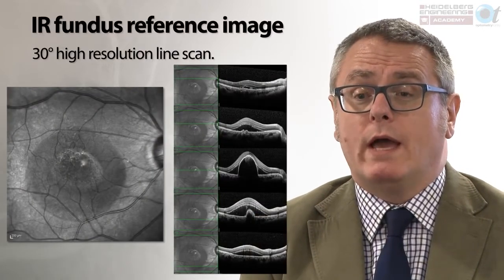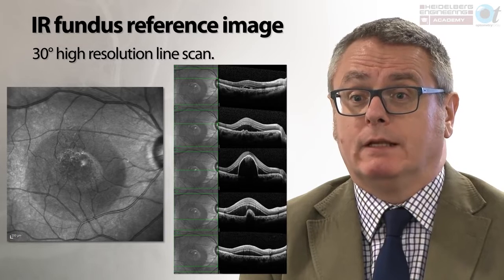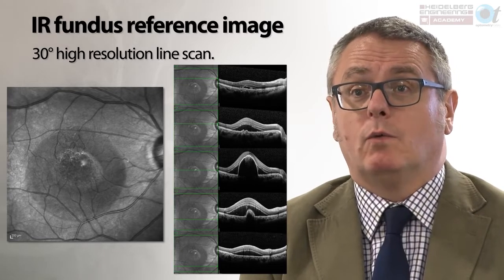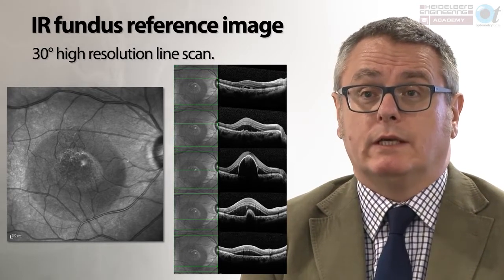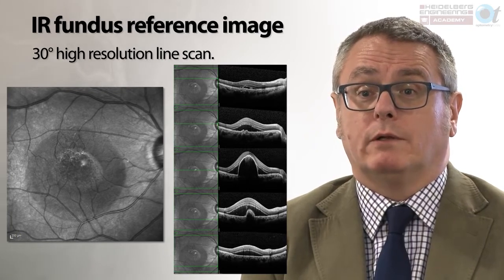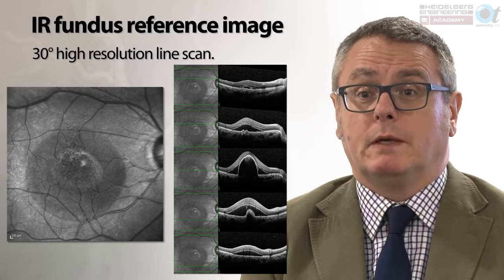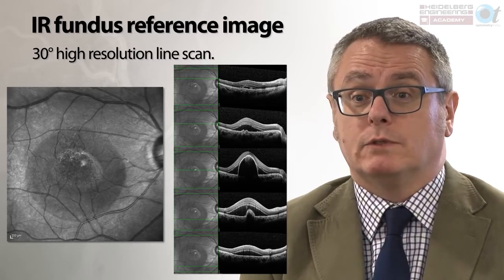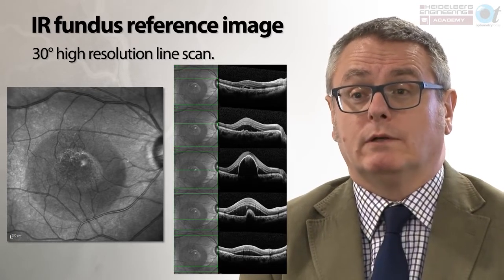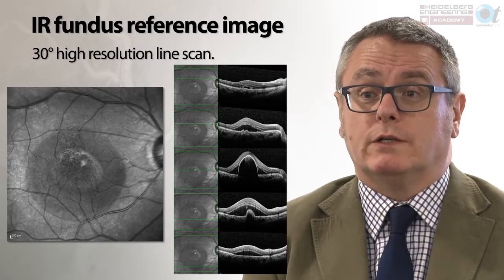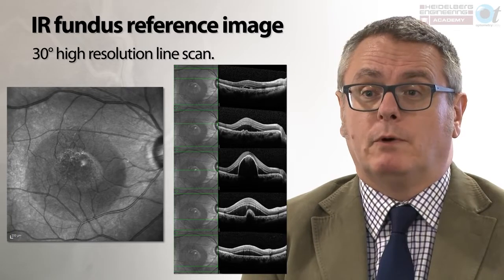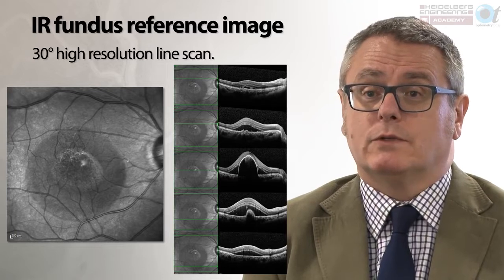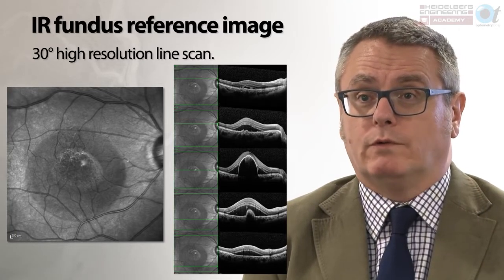The first question is where do you place your OCT scan? The simple answer is use the clues you see within the fundus reference image to guide where that should take place. In this example we can see a patient exhibiting a large area of subretinal fluid with a central oval-shaped pigmentary change, probably consistent with a retinal pigment epithelial detachment and associated subretinal fluid. When we look at the OCT cross sections there is evidence of both changes, but the profile changes dramatically depending upon the location placed within the eye. A single scan on its own is not going to provide all the information required.